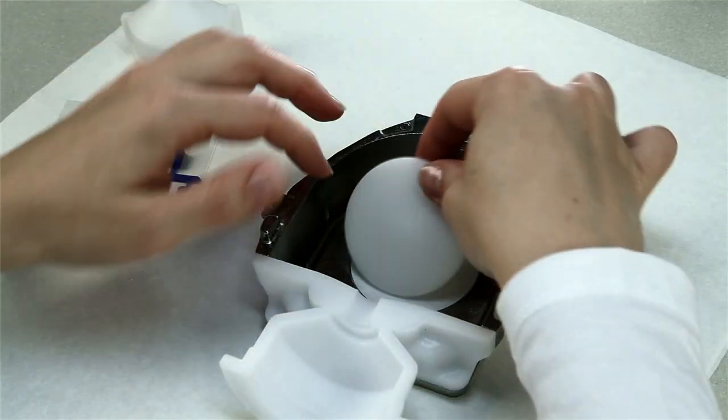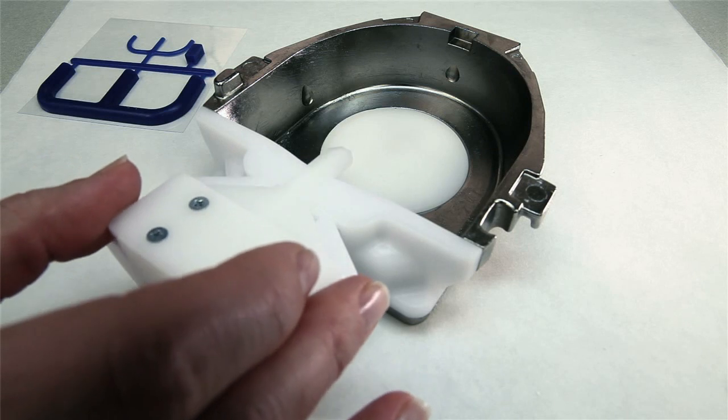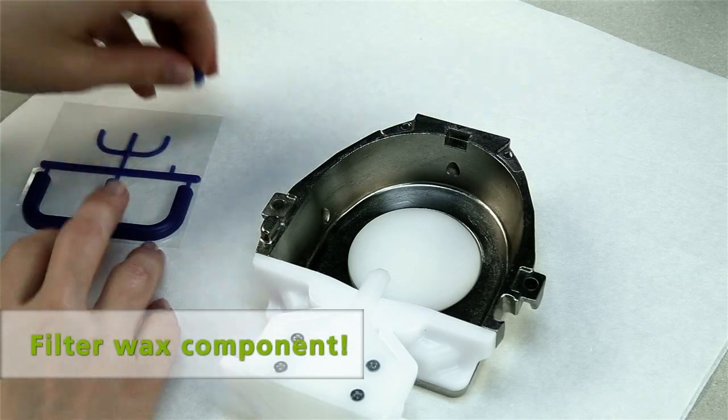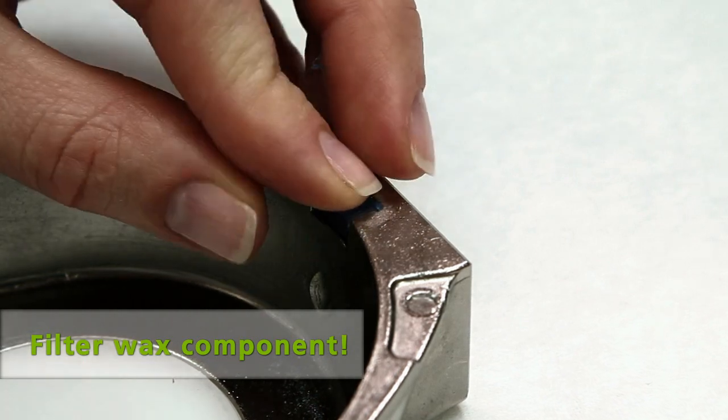Now place the flask lid, the excess former half, and very important, the filter wax component in the recess intended for that purpose.